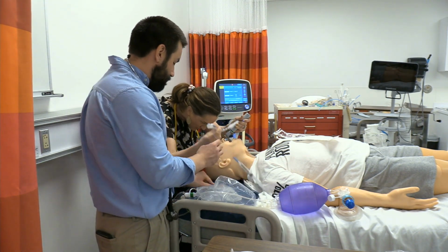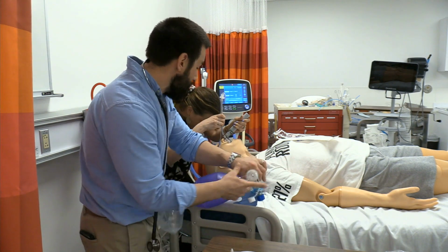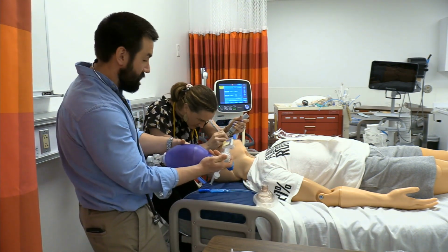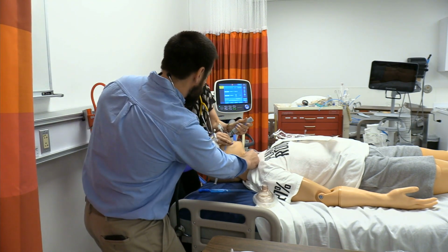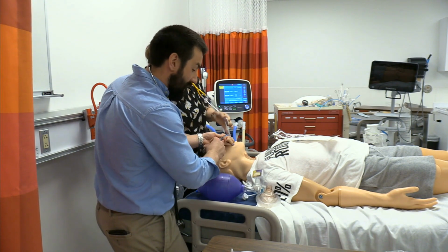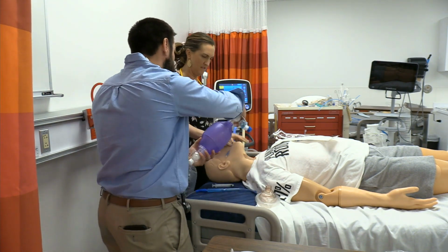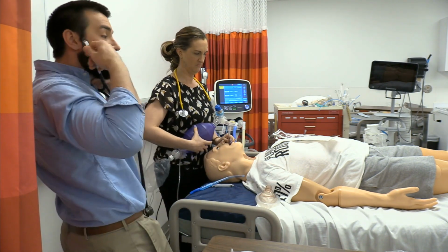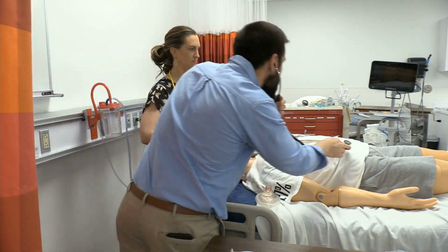All right, tube. So I'm hoping she's going to get it in, so I'm going to get my CO2 ready and just have it on my bag like this on the connector side. That's stuck it in pretty far there. So cuff's up. You want to be very verbal. Don't give a breath until I listen over your belly here. Make sure you didn't go in the wrong spot again.